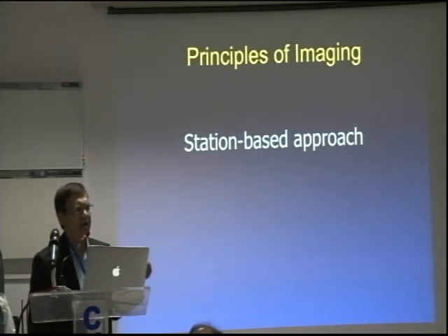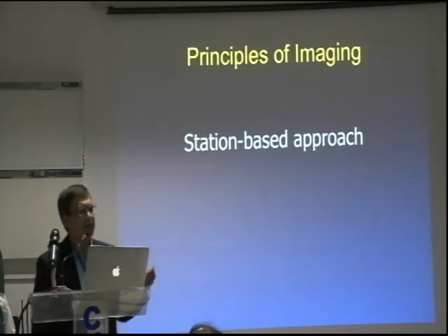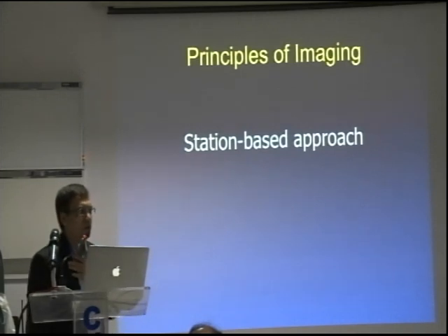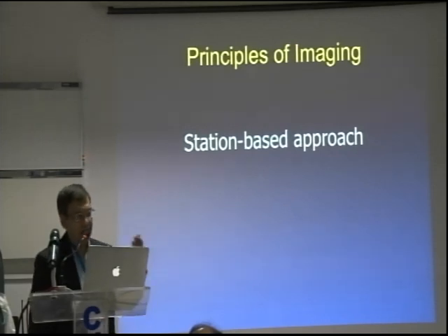But remember, every time I do an EUS, even now in 90% of the cases, I do a complete EUS. I have this sequence in my head that I have to go through.